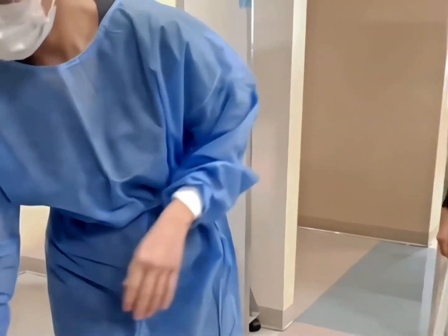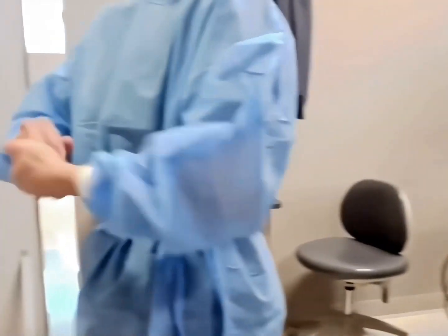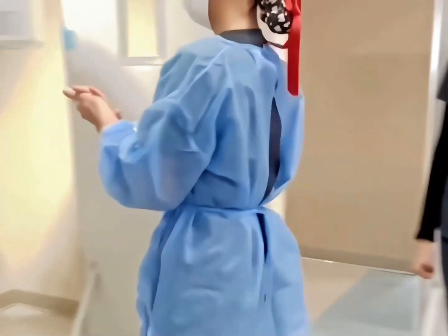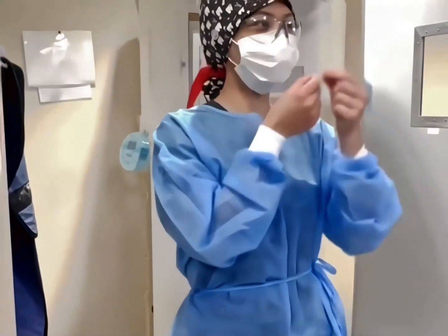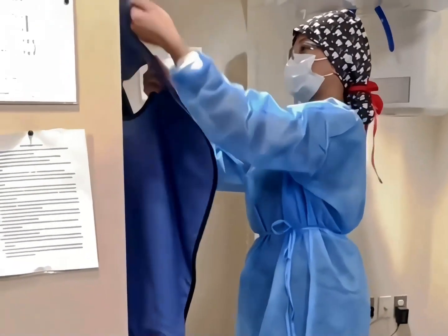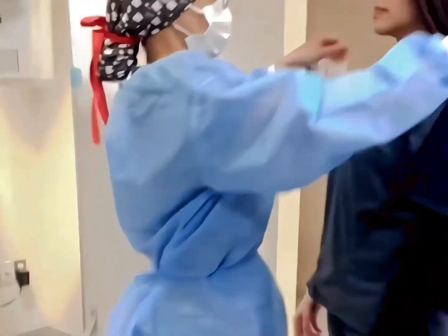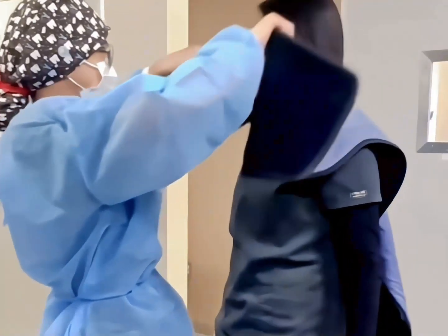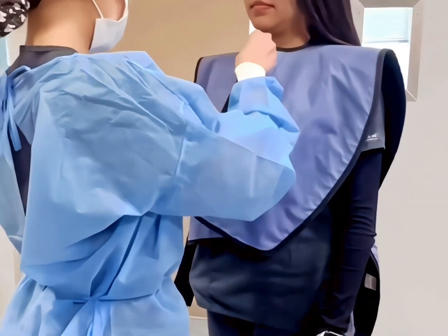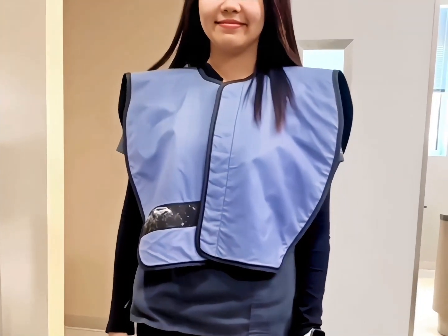After making sure all the metal objects on the patient are removed, the clinician will use their clean bare hands to place the lead apron on the patient. Unlike the lead apron for intraoral X-ray, the lead apron for panoramic doesn't include a thyroid collar. In PAN imaging, the primary beam is directed slightly upward, resulting in negligible radiation exposure to the thyroid gland. It is a double-sided lead apron designed to protect the patient. To avoid blocking the X-ray beam, the lead apron should be positioned lower around the neck.